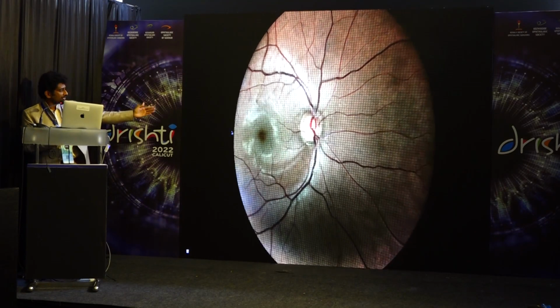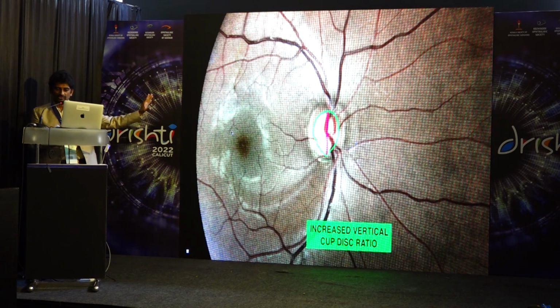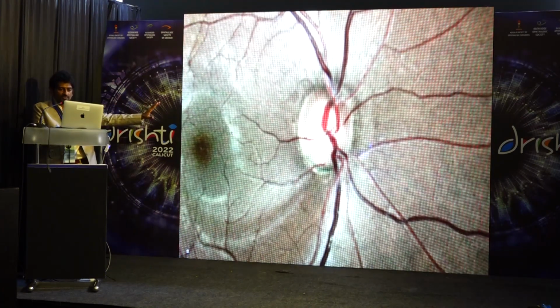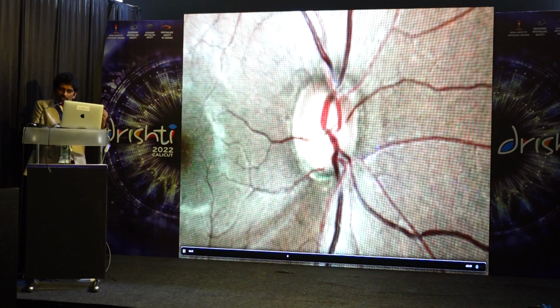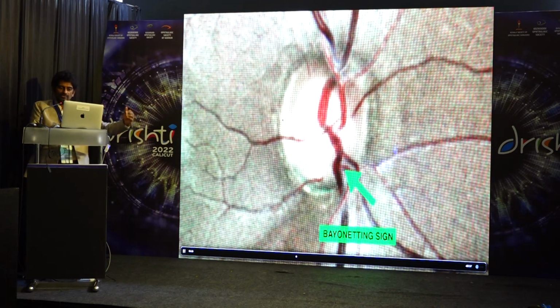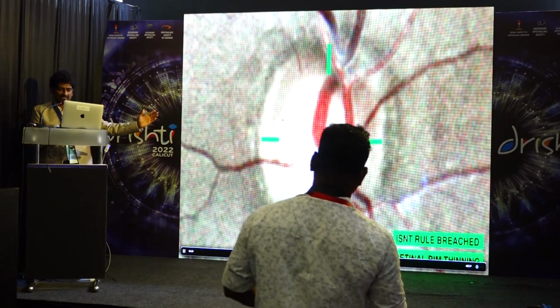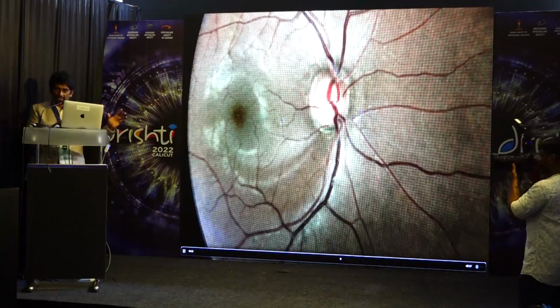This is one of my own videos where you can see the fundus of a patient. We just marked the cup and showed that the cup disc ratio is altered with increased vertical cupping. Then the video was slightly zoomed, and you can see that the inferior notch is marked. Then we can go even more zoomed, and we can show the bayonetting sign, and then the basic sign is the ISNT rule. How is it actually breached? You can see that the inferior is lesser than the superior, coming back to the RNFL.